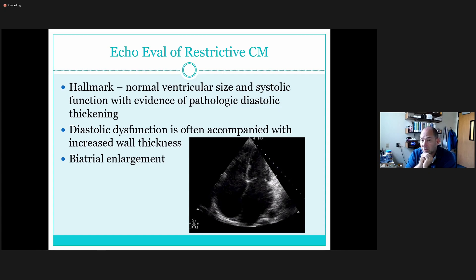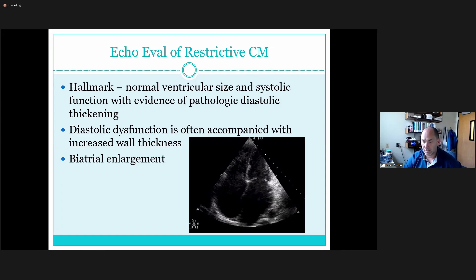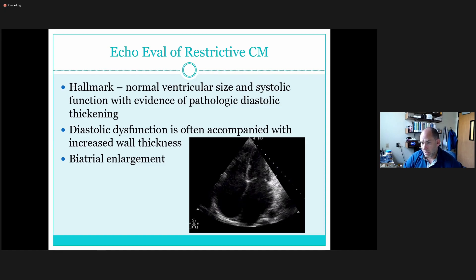LV mass index — in an adult lab it's not done that much, but in a pediatric lab they do it all the time because they want to see the muscle bulk. It depends on the lab. Some might do it, some might not — Tammy confirms that in the pediatric lab it's essential, whereas adult labs don't do LV mass index very much. It's not a hard measurement, but it gives you an idea of how thick the walls are and how much muscle bulk is there. We look at them in 2D, measure them, and want to see their function.